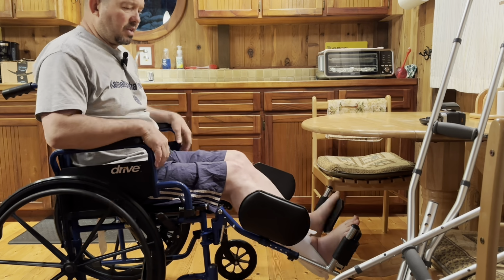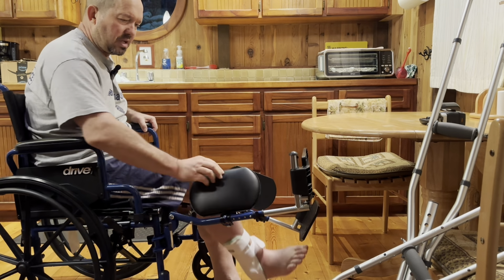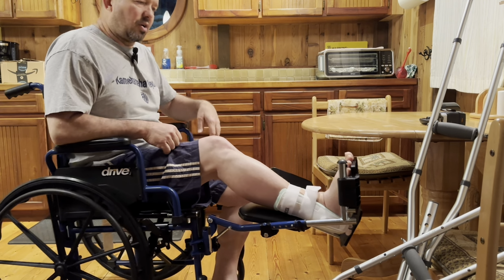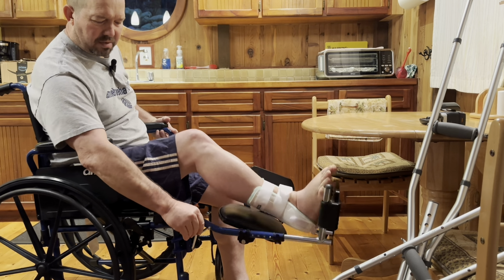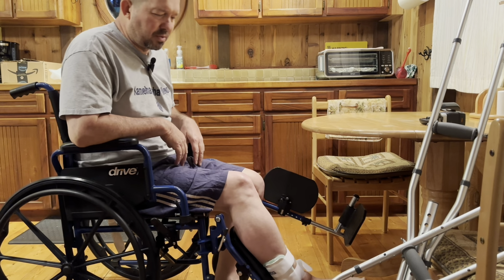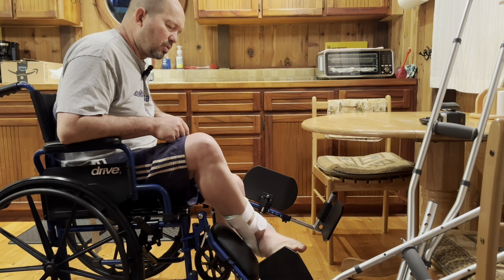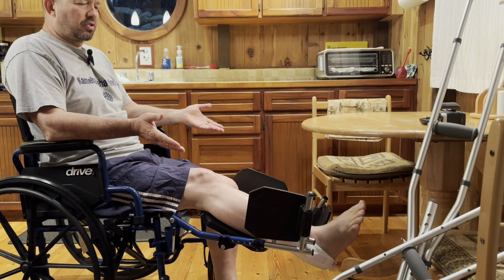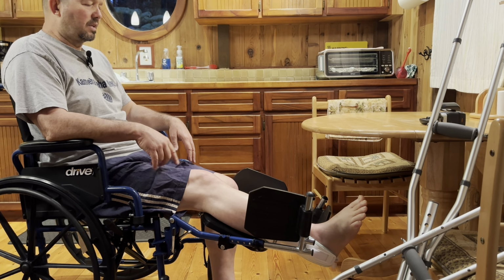But what I don't like, it looks like the leg lifts are too short for me. If I try to stretch my leg out on this while all the way back in my seat, I can't do it. So I ended up just using it like that all the time because the leg lifts were useless because they seem too short. And even if I were to fold up the foot part, lift that up, this might be better for a shorter person so that they can fully extend their leg. You can see how my leg's much longer than the leg lift is.